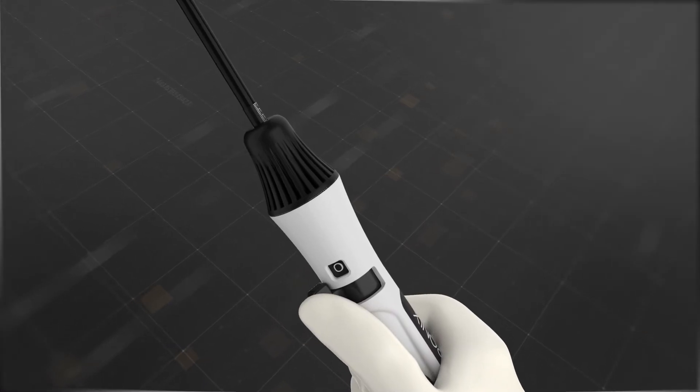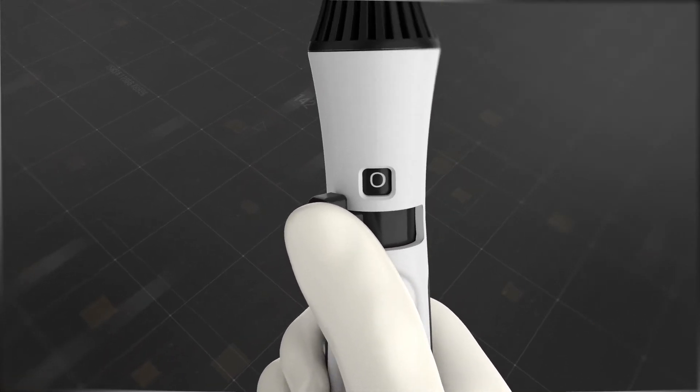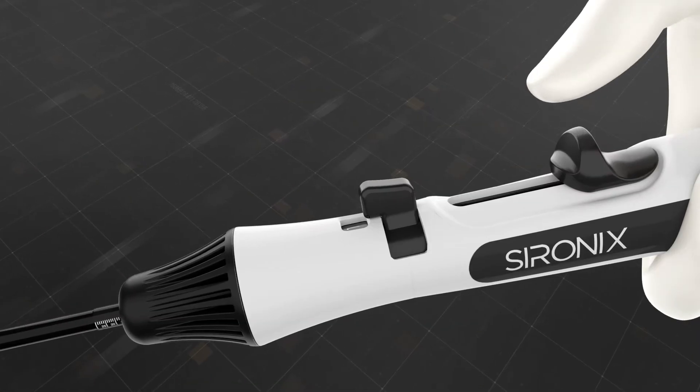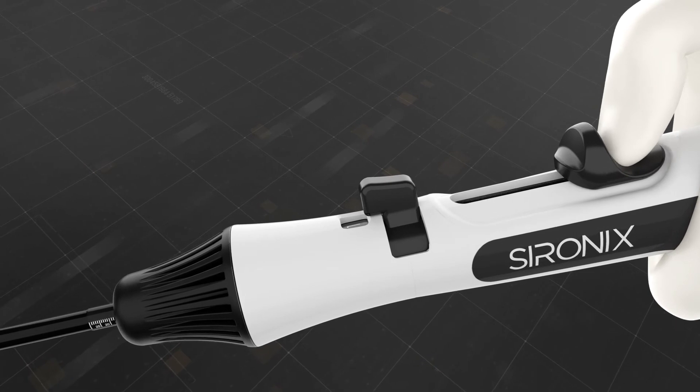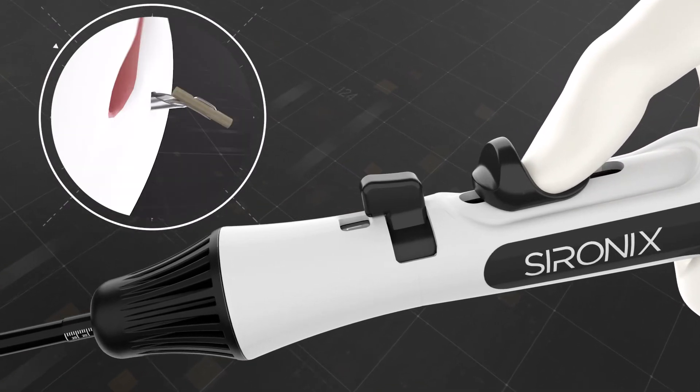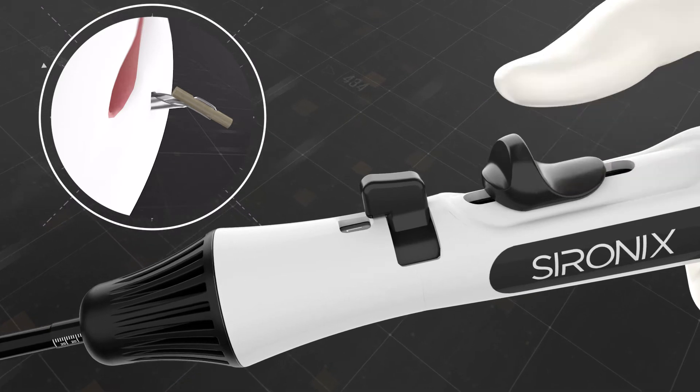Now, prepare to deploy the first implant by turning the safety knob from safe position zero to active position one. Advance the deployment knob using the thumb until an audible click to deploy the first implant. Then release and allow it to spring back to its half position.